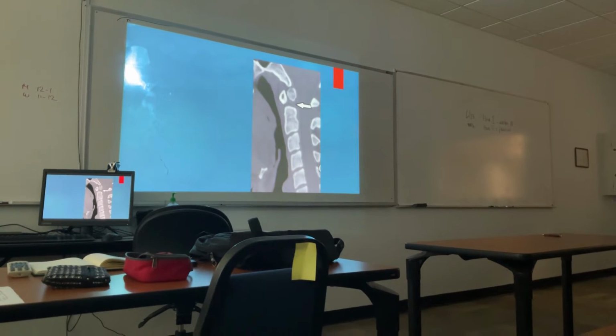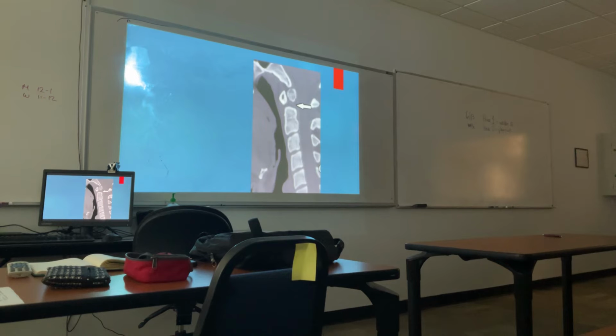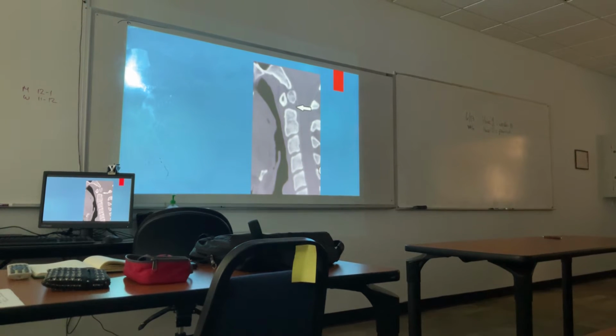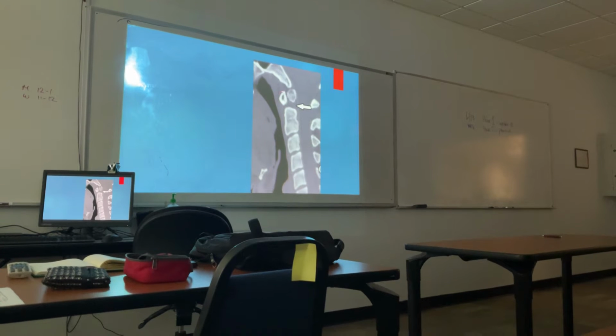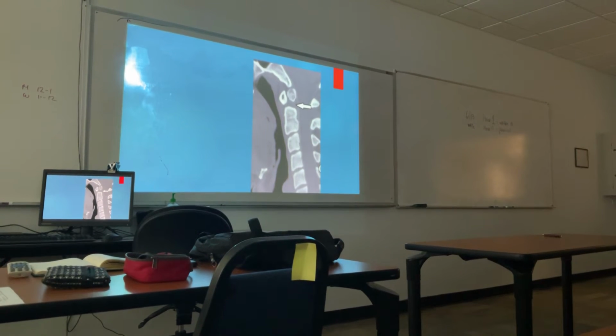It has now become chronic, all right? Now somebody could say, you missed the fracture. No, I didn't. This is old, because I've got smooth margins and I've got an enlarged anterior tubercle. And it's still not trauma class, I'm just telling you, this is how we use the information that we learned last semester, okay?